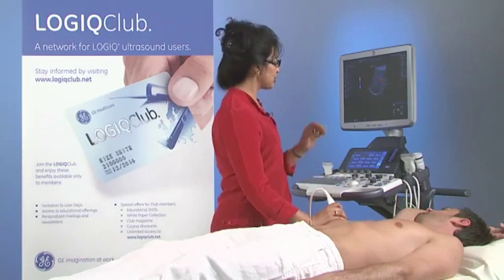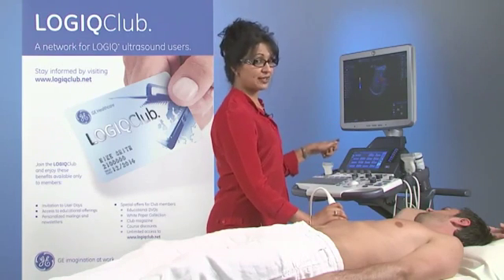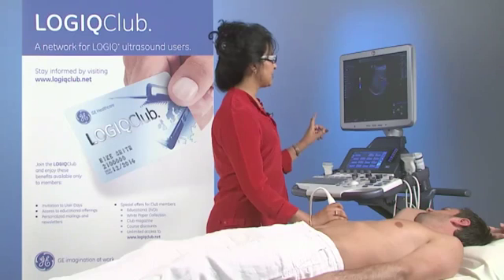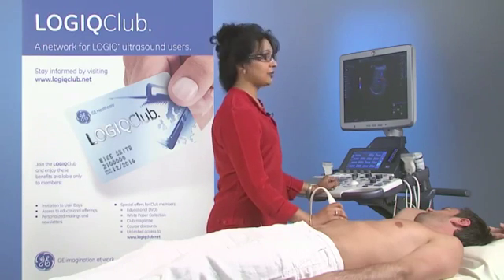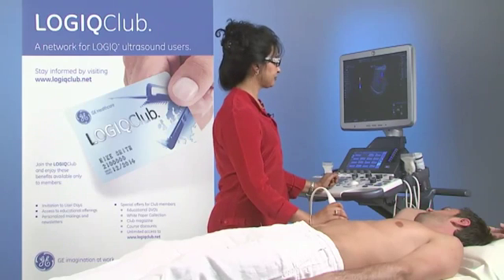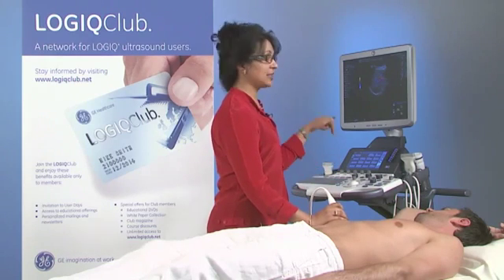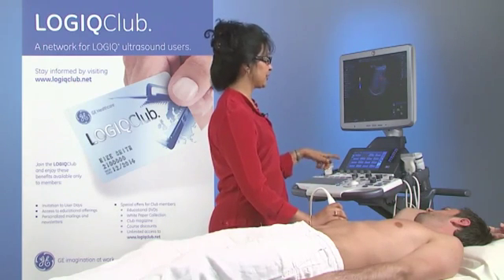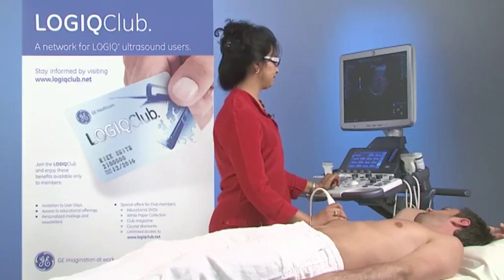If I have too much color in my image, then I will want to actually reduce the gain slightly and increase my scale or PRF so that I don't get aliasing within the vessel. And I may also want to adjust my frequency accordingly. So if I was looking deeper, I would want to reduce my frequency. If I was looking more superficial, I may want to increase it for resolution.